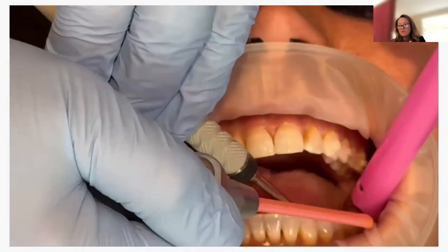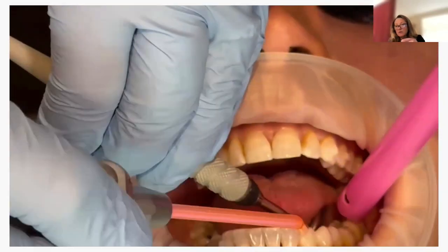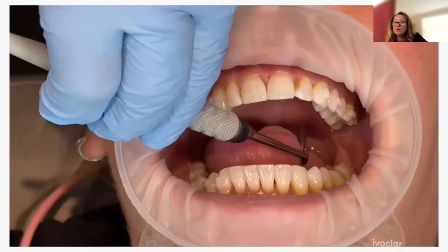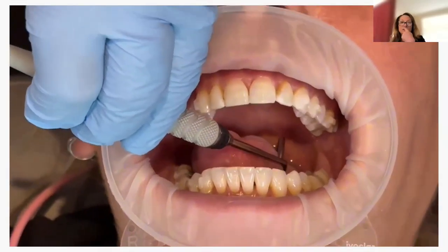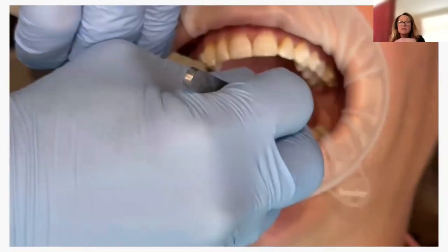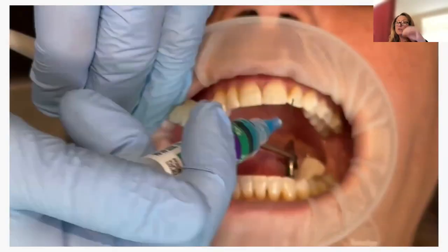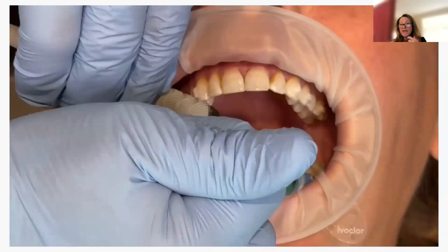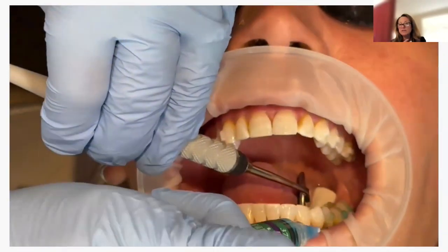So if you have a 30-second etch, and you have 4, you don't count when you first started etching your first tooth. If you're doing 4, it's after you etched your 4th tooth, then you count your 30 seconds or 45 seconds, however many. Then you're going to do the rinse, dry, depending on how much saliva they have. It's not as long as you think it is.